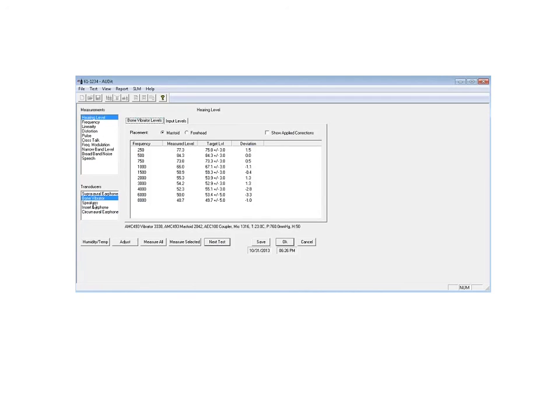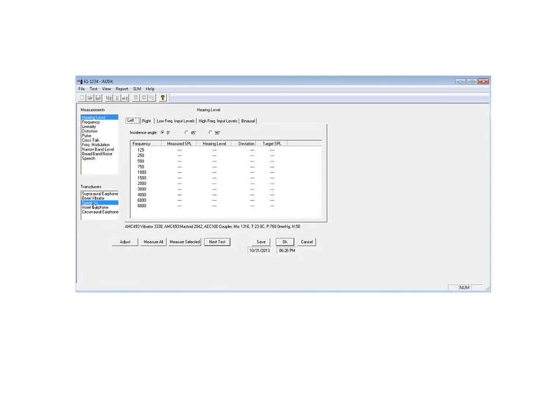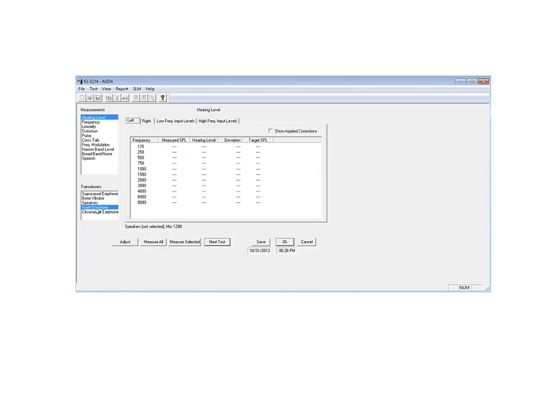Some clinics are set up with a nice sound booth, which would have speakers mounted in the booth. And so there may be speakers to test. The insert earphones can also be tested. And the last one in the list is called the circumaural earphone.